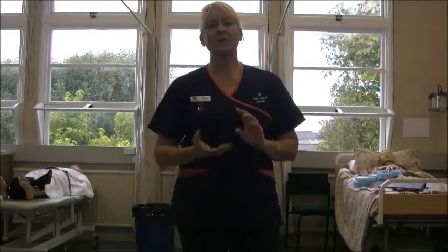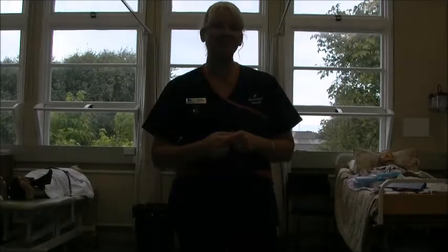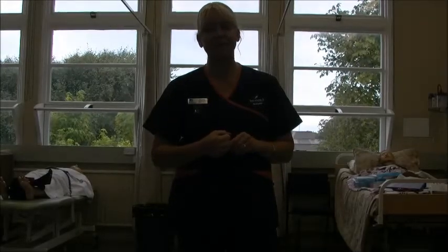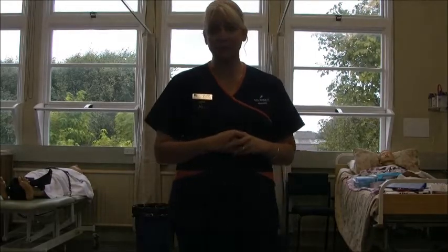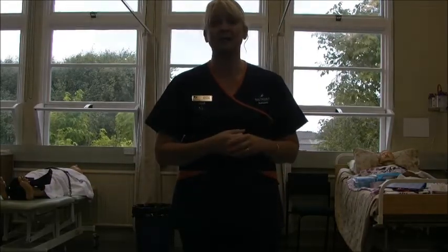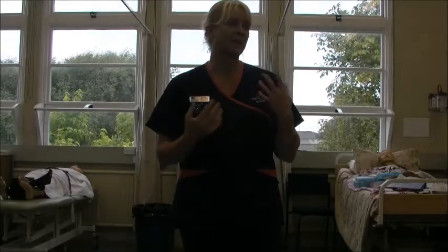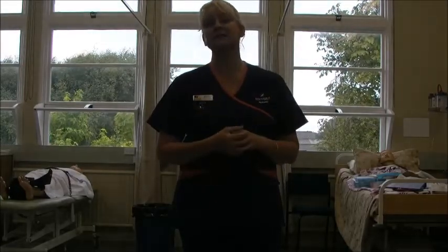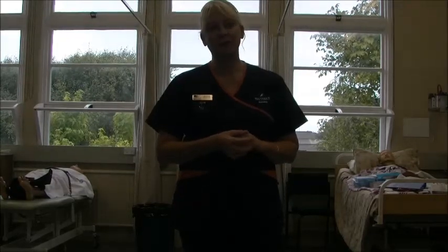Okay, so what I know about George is that he's a 45-year-old man that's come into the ED after a 2-day history of diarrhea and vomiting, which they think he became unwell after some food, so potentially food poisoning. So what I've been asked to do is do an assessment of his cardiovascular system and his neurovascular system. I'm also going to be putting up the IV fluids.